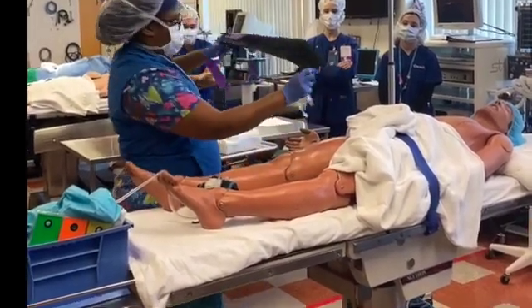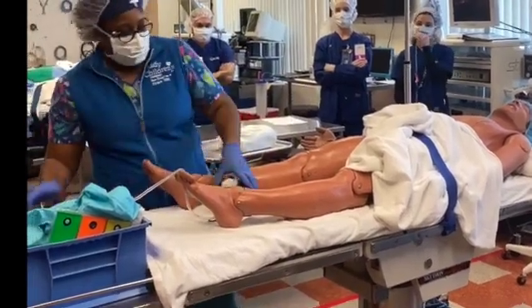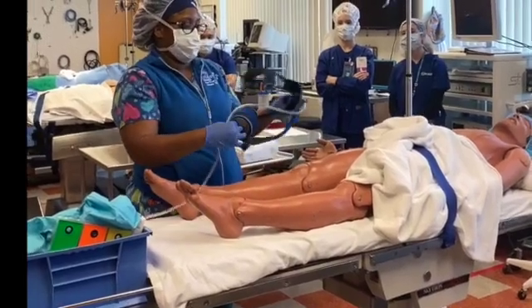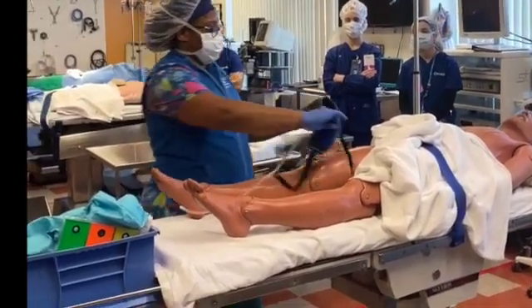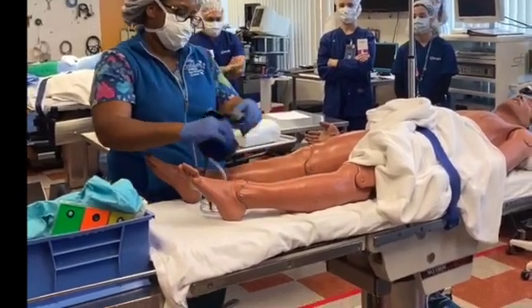What do you guys think? No? I don't think so. I think that's too small. Blue, please fit, because that's the only other size we got. Yep, we're good. Assess skin site before application of tourniquet.